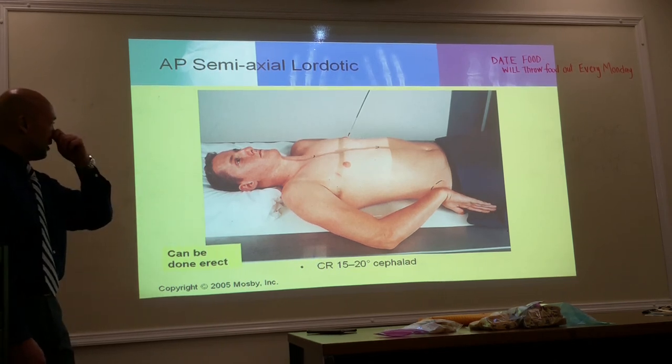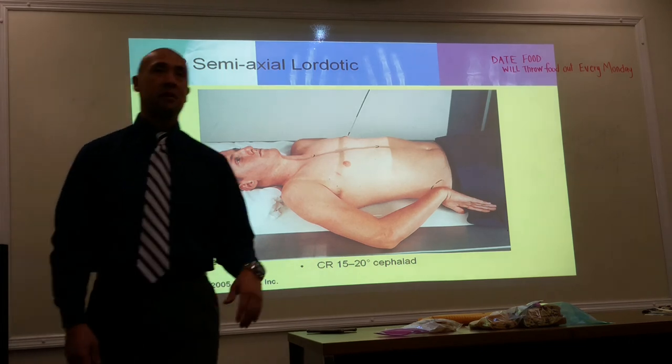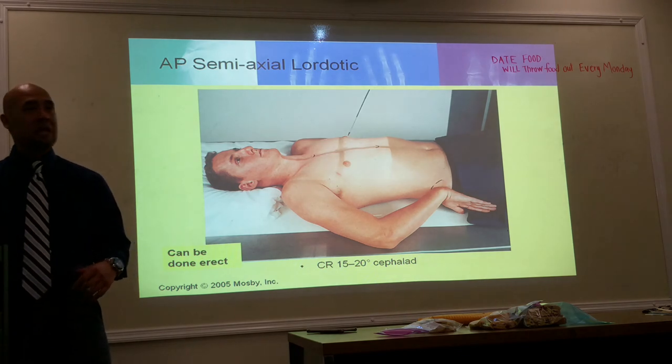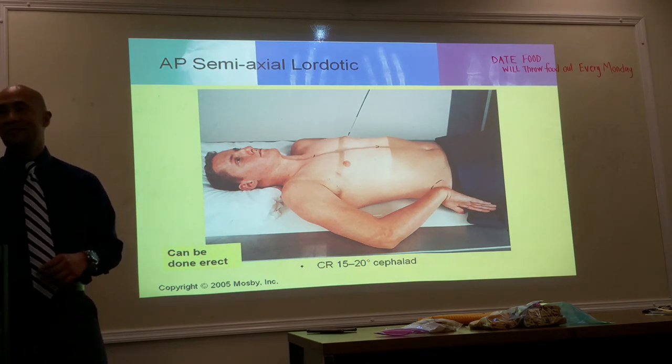Here, as demonstrated with a patient, again, hand on their hip, we want to roll their shoulders forward to get the scapulae out of the way. Scapulae is plural, right? Yeah, scapulae out of the way.